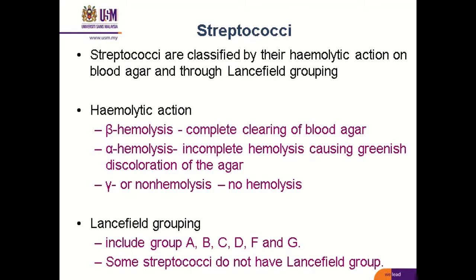After that, we can do Lancefield grouping to group the streptococci into groups A, B, C, D, F, and G. Some streptococci do not have Lancefield grouping.